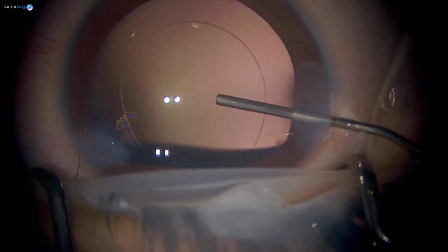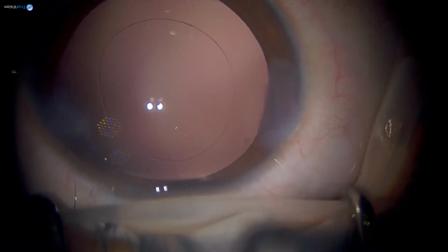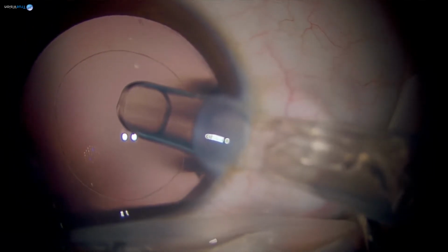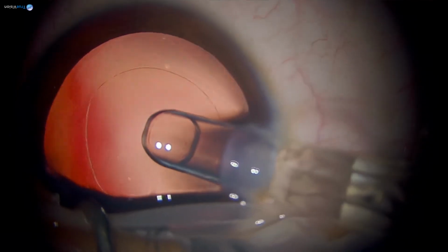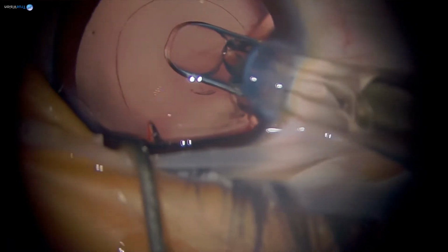Yes. With regards to the size, I used to aim for 2.5 millimeter earlier, but what we found down the line is that they grow larger over a period of time. So now I aim somewhere between 3.5 to 4 millimeter, around 1.5 millimeter less than the anterior capsulorhexis size. How deep? Just behind the posterior capsule.